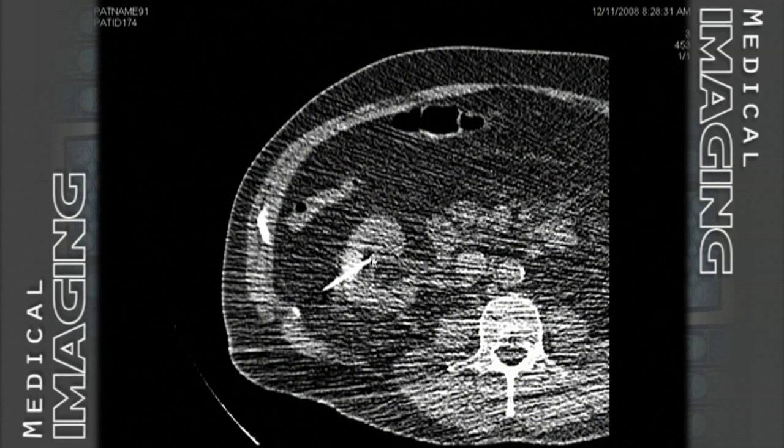They arrive at this position, and you can see that the needle tip, or approximate needle tip, is located right at the base of this suspected area or lesion. And it is from this point that the cryogenic probe will be energized, and oftentimes more than once over a period of half an hour or 45 minutes. And then further scans will be taken to see what the reaction is of the mass and the tumor, and the kidney itself.